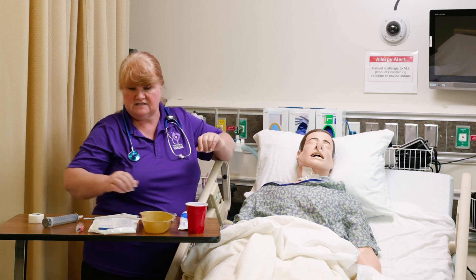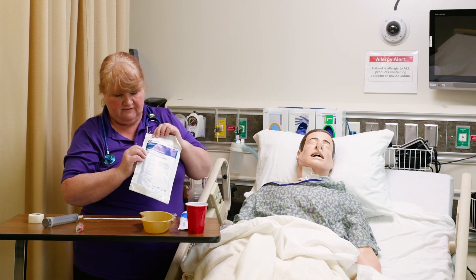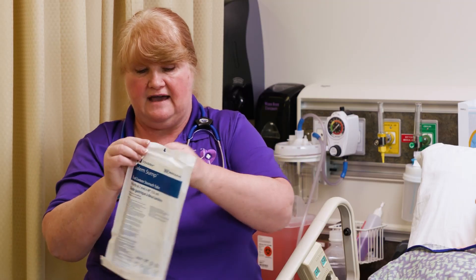One of the first things you want to do is make sure that you know it's a 14 French, and it's a Salem sump. You'll need to know that for documentation.